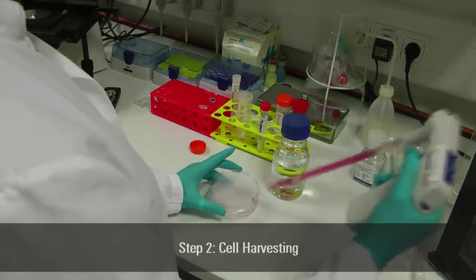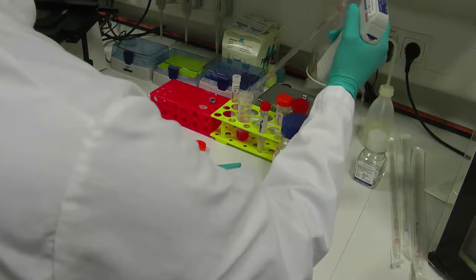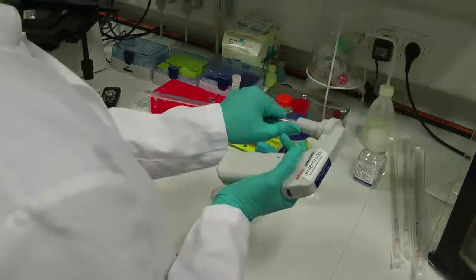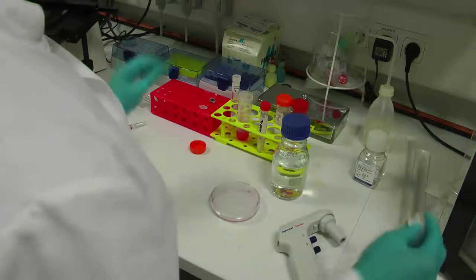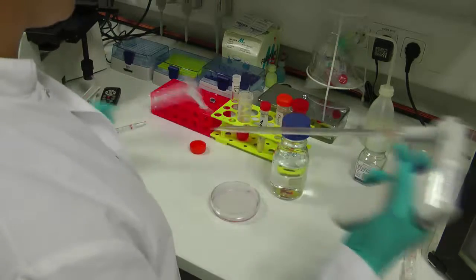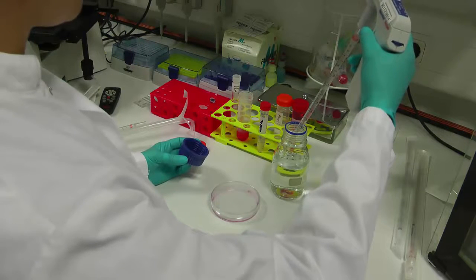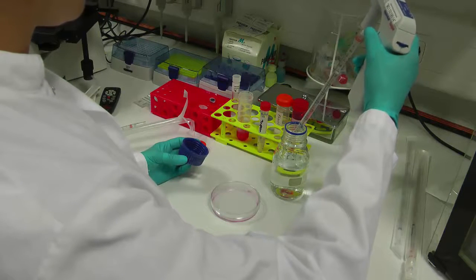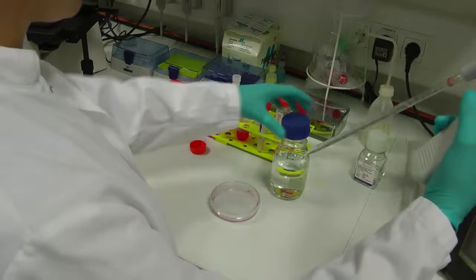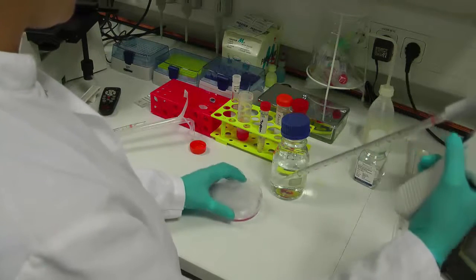Pipet off the medium from cells into a waste container. Carefully wash cells up to 3 times with 5-10 ml pre-warmed PBS without calcium and magnesium to get rid of the fetal bovine serum in the residual culture media. FBS will inhibit the trypsin.